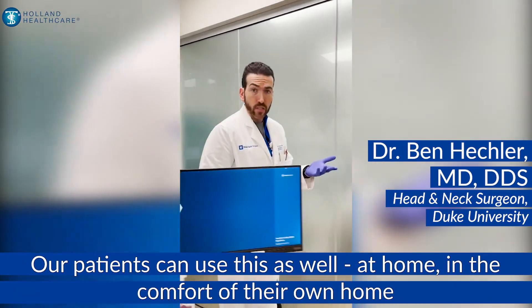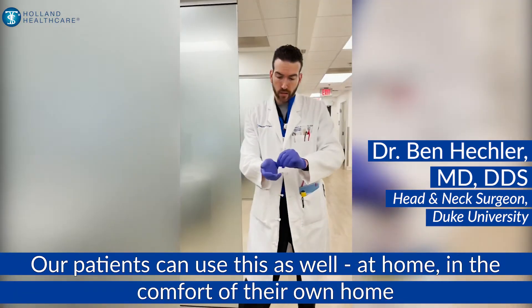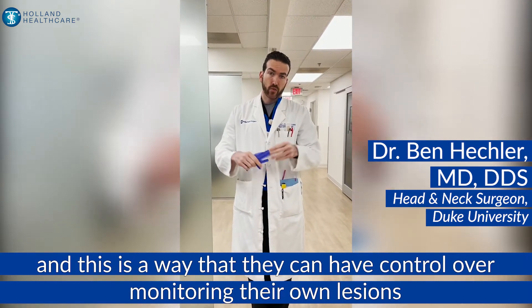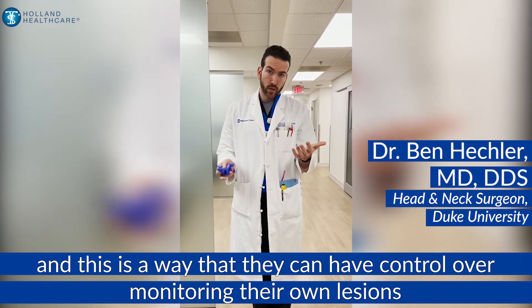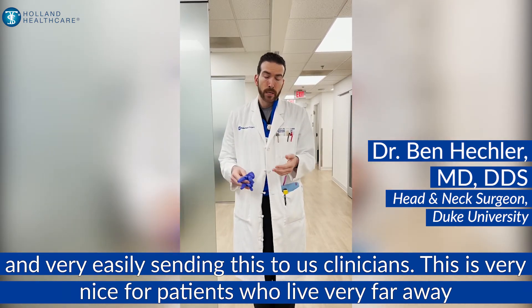Our patients can use this as well at home, in the comfort of their own home. This is a way that they can have control over monitoring their own lesions and very easily sending this to us clinicians.